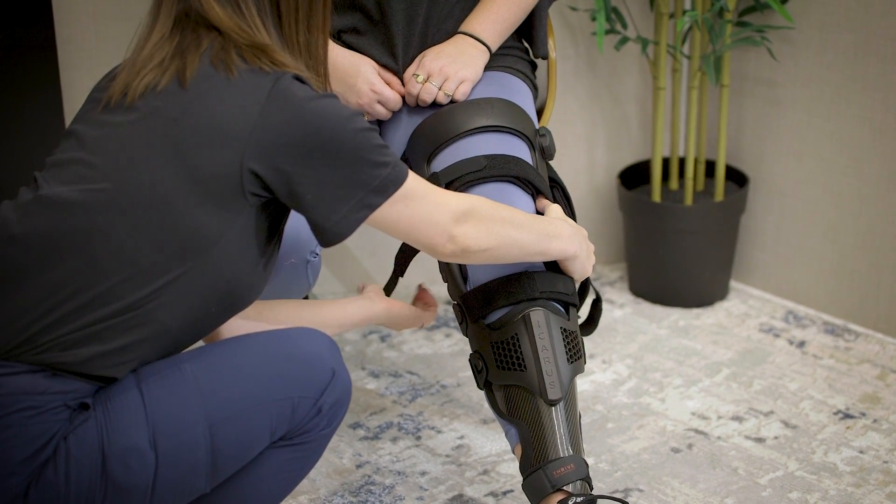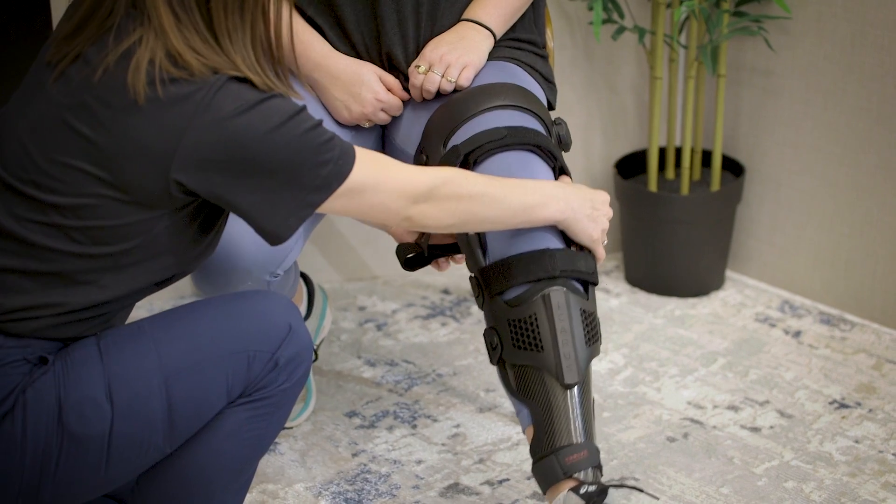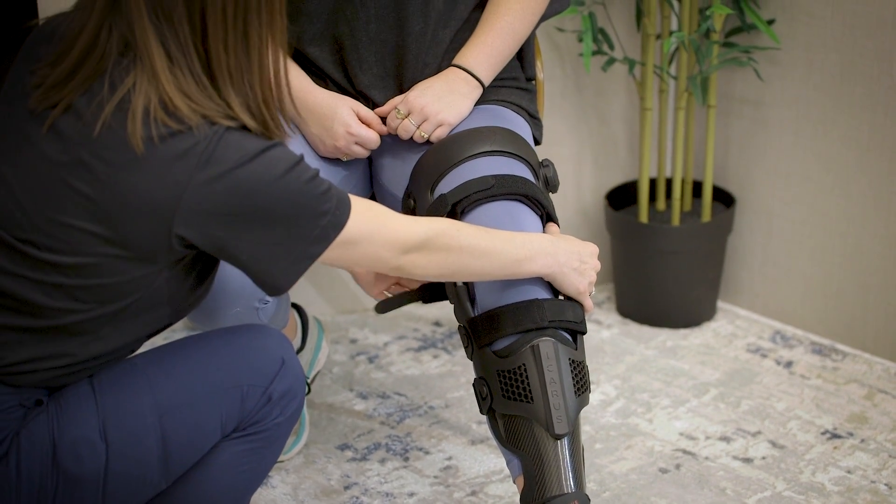We advise the brace be hand washed and air dried fully before wearing it again. Additionally, components of the brace may be damaged at temperatures over 125 degrees Fahrenheit.